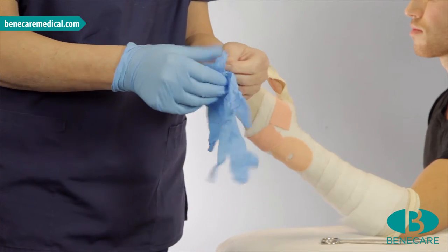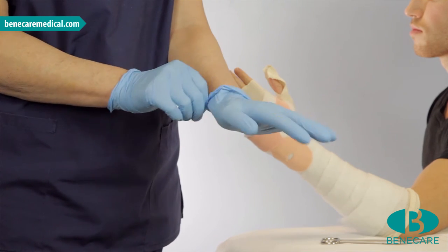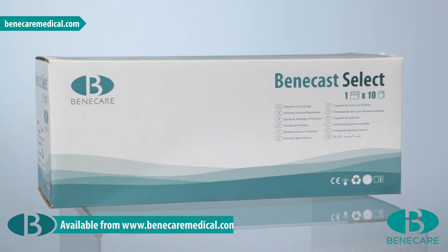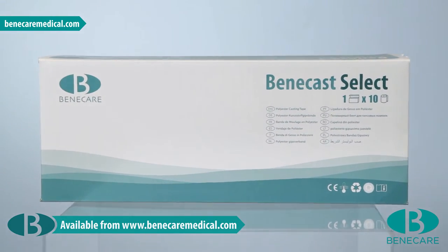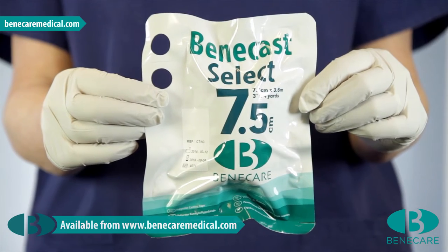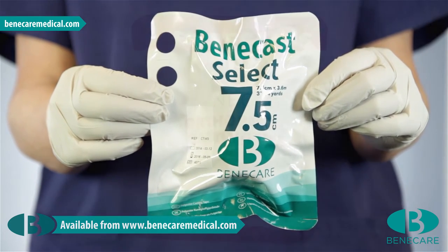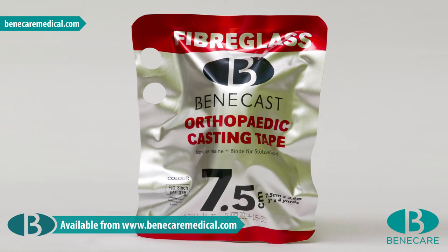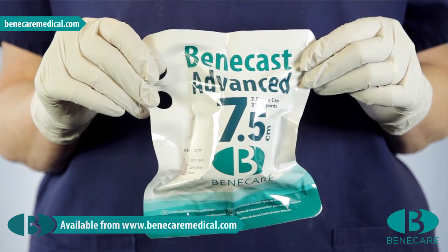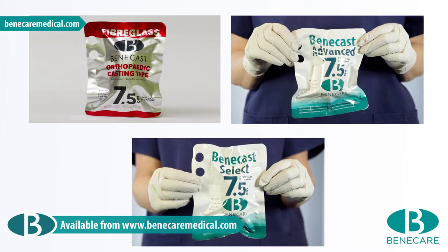Apply examination gloves, as it is important when using synthetic casting material to prevent the polyurethane resin from sticking to your skin. The material of choice today is Benecast Select Polyester. This polyester has very similar characteristics to fiberglass, with all the benefits of a polyester. However, other suitable products for this application would include the Benecast Fiberglass and the Benecast Advanced Polyester casting material. The choice would depend on the indication and your clinical preference.